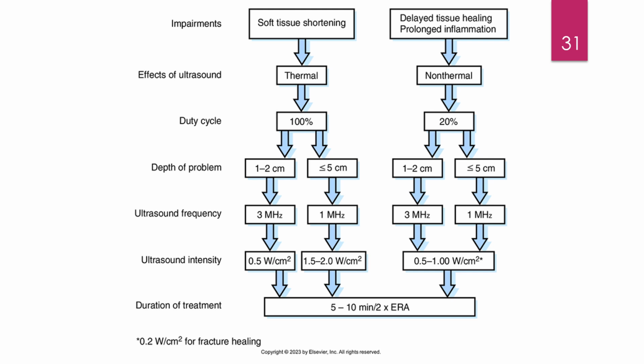And then from there, you just have to make some decisions based on your own clinical reasoning. So what is the depth of the problem? Is it superficial, as in 1 to 2 centimeters deep off the skin, or is it close to 5 centimeters? If the depth of the problem is 1 to 2 centimeters superficial, then we're going to use the frequency of 3 megahertz.